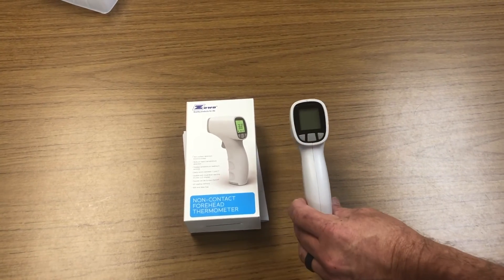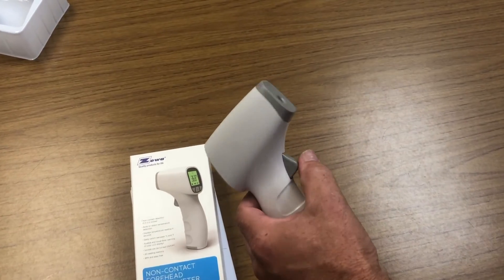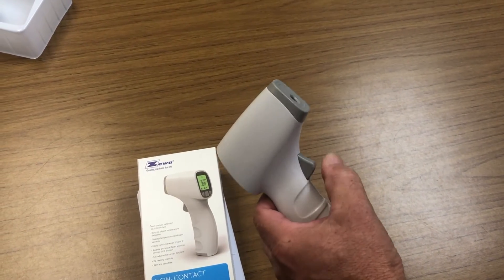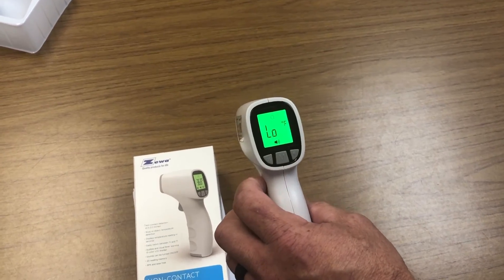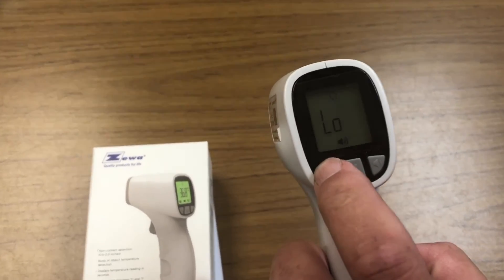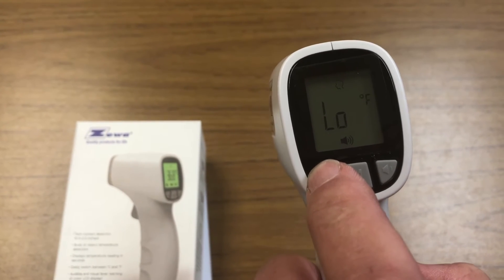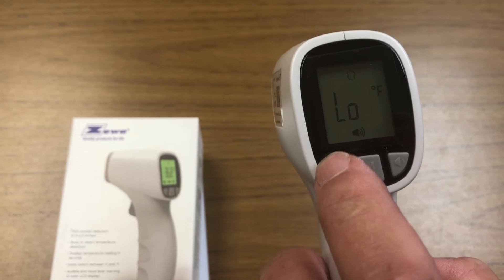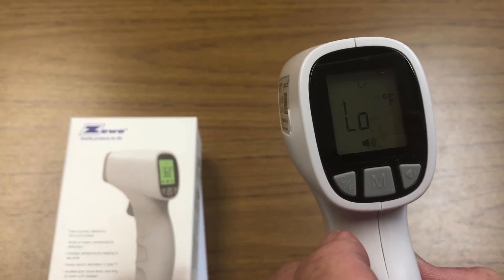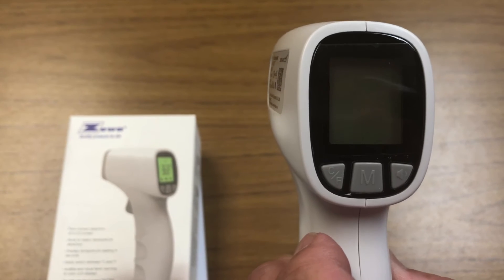This is the Zewa thermometer, which is provided by the state. To activate it, there's a button on the front — pull it and let it go and it will light up. On the back, if someone hits the Celsius/Fahrenheit button, it will toggle between both. It needs to stay on Fahrenheit. This thermometer also needs to be within two inches of the forehead — if it's further back, it will show 'low.'